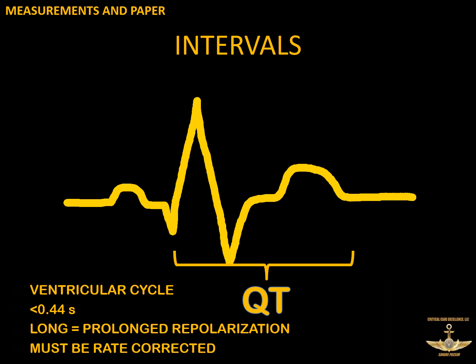But understand that the longer the QT interval gets, then the more likely you are to have malignant rhythms, which can get in there and cause the patient to go into VFib or VTAC. That's very hard to get them out of. There's a lot of medicines that cause this to happen. There's a lot of conditions that cause this to happen. It's one of those things that as you get sicker patients who are on more and more medicine, we have to pay really, really close attention to. So we really watch the QT interval closely with some of the interventions we do. And it's one of the things that's going to print on your EKG paper when you're looking at that, in addition to things like ST elevation and depression.